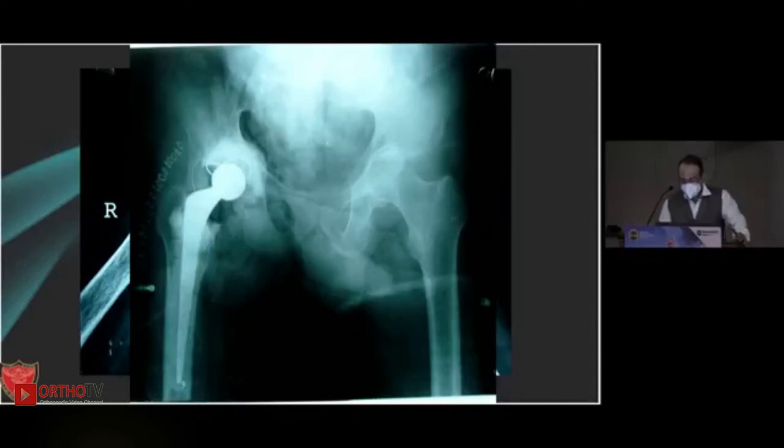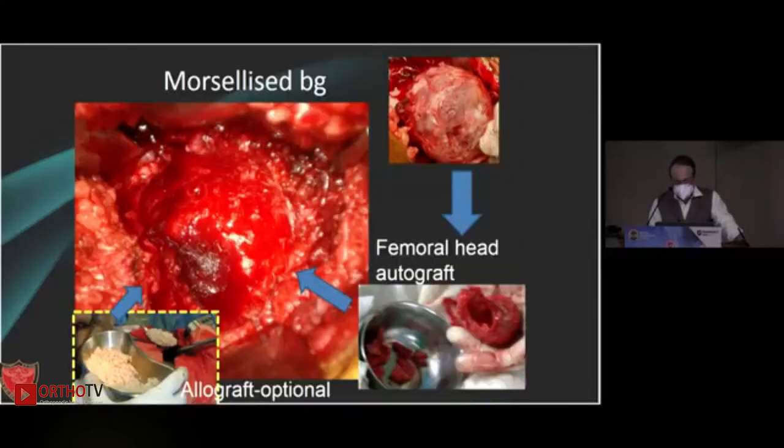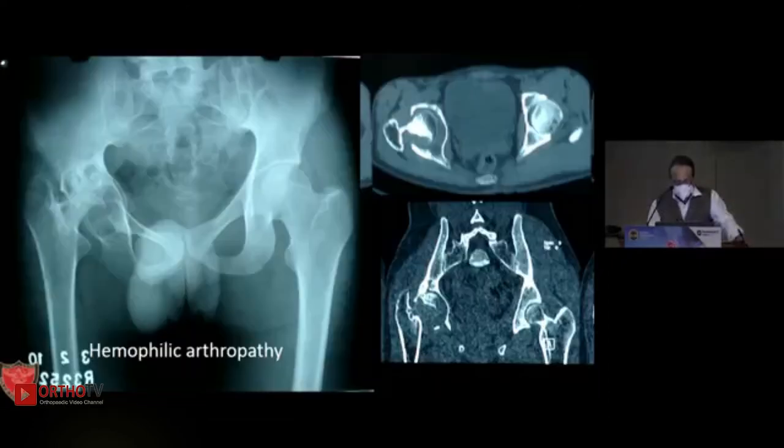Here, because of the osteoporosis, we prefer to use impaction bone grafting — that's a two-year follow-up, and again this is almost seven to eight years of follow-up. Irrespective of your philosophy, if you follow the principle it should last longer. That was done with allograft femoral head, autograft, and some bone graft substitute. If you are using a cemented cup, I think using a flange cup does help — it does not bottom out and helps in lateralizing the cup.